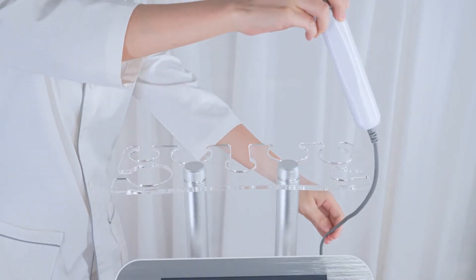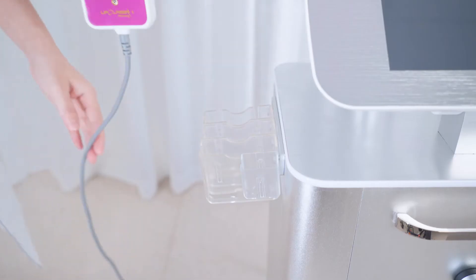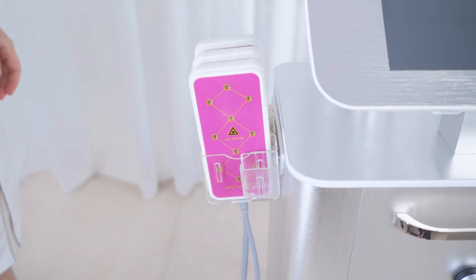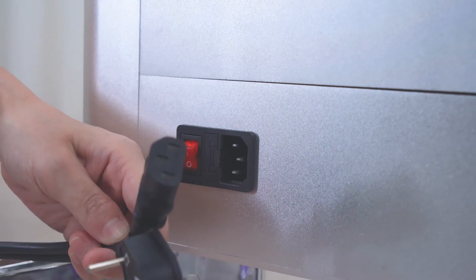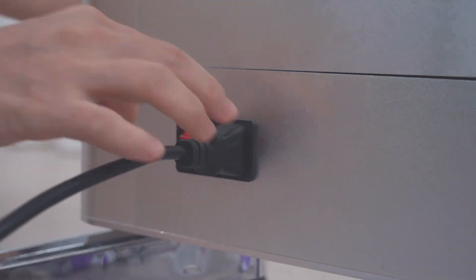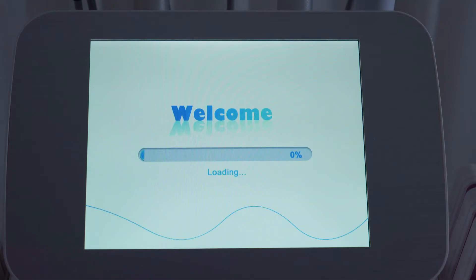Put all the installed props on their corresponding brackets. Install the power cable. Check to ensure all props are installed, then switch the device on. Click the on/off button on the device. Select functions after switching on.